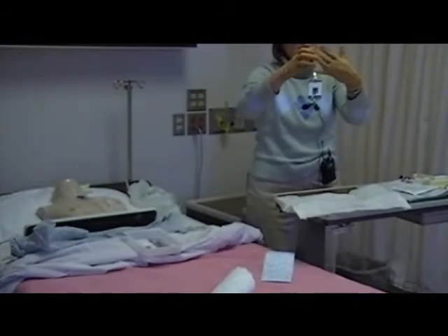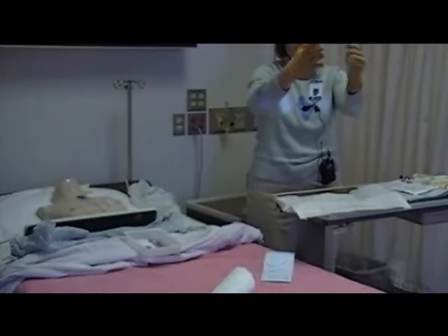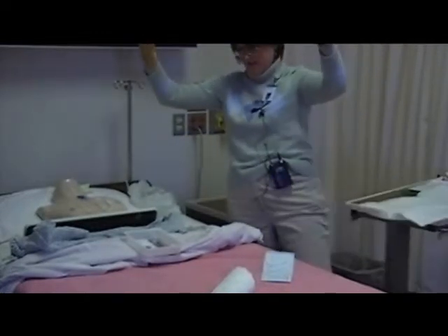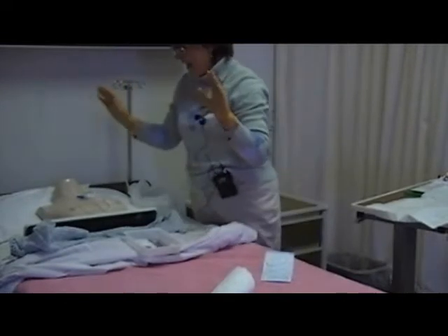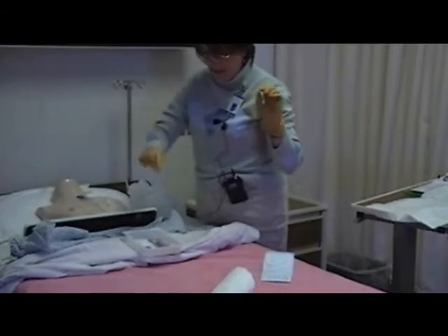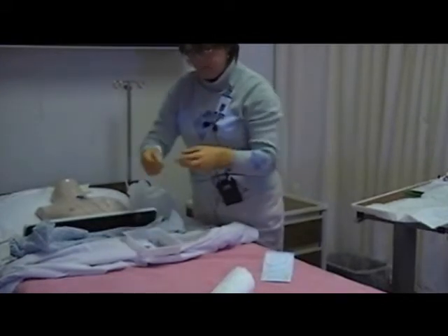You guys are not the only ones who get your fingers in the wrong spots. Okay, so gloves are on at this point. Everything's looking good. I'm going to go ahead and grab my chlorhexidine.